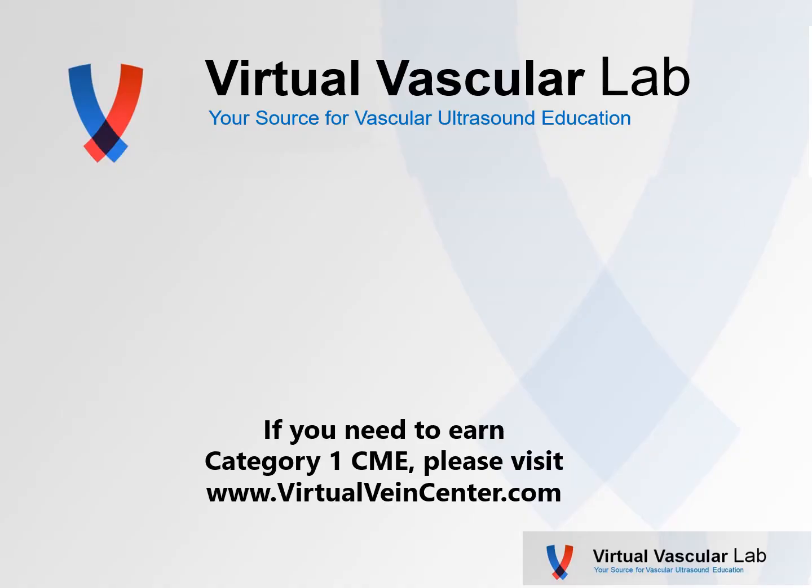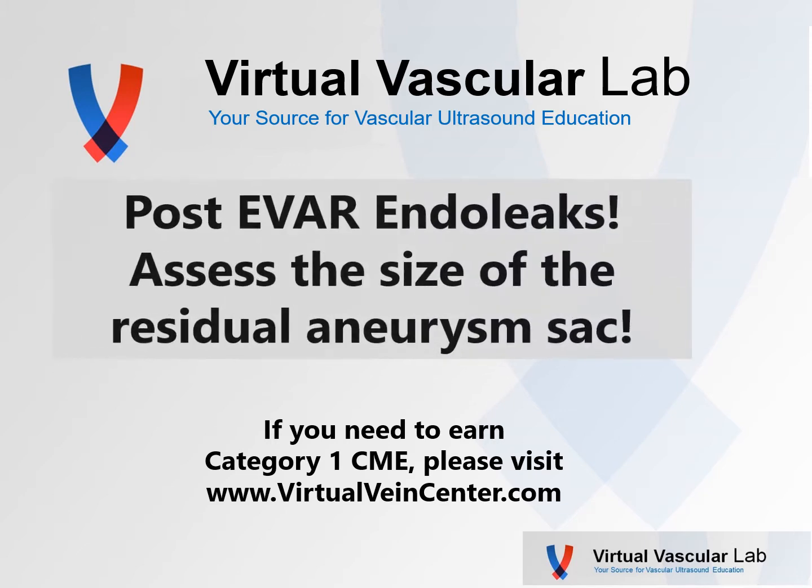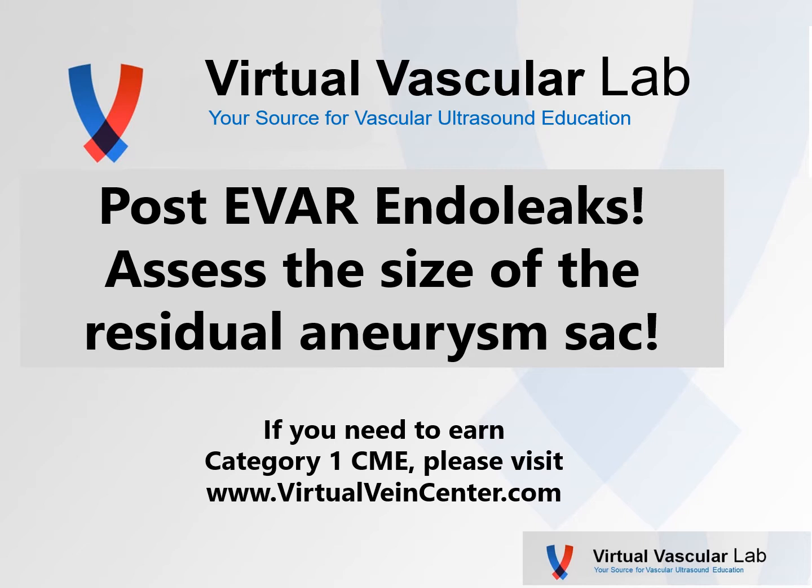So when you're evaluating that patient post-endovascular aneurysm repair, looking for endoleaks, certainly you want to see if you can detect flow in that sac. But one of the most important things is to assess the size and echogenicity of that residual aneurysm sac. Remember, it should get smaller over time. Additionally, it should become more hyperechoic. When you see one that's dilated or not decreasing in size, and it has that hypoechoic echogenicity, suspicious for thrombus and/or blood flow, think endoleak.